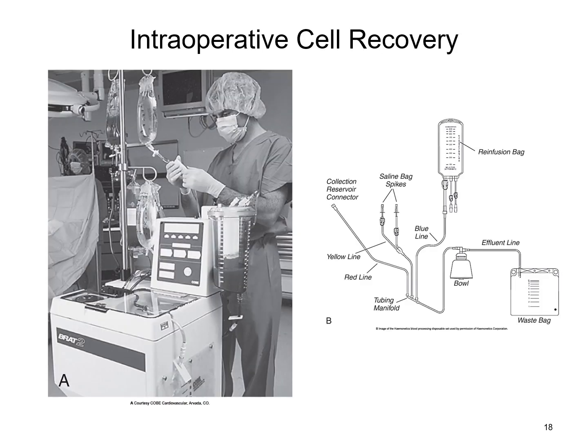And of course, here you can see the process of that intraoperative cell recovery. You can see where they're removing that blood, and it's going to go through that process of filtration, and then this is probably the wash solutions and things like that, and then it's going to go back into the patient themselves.